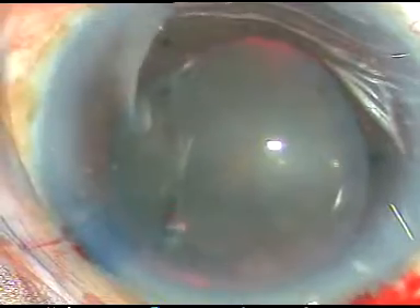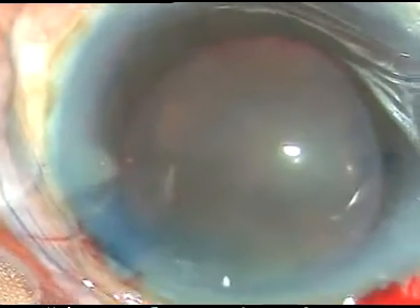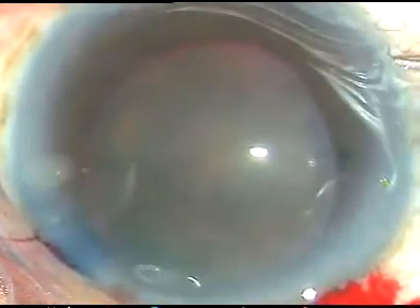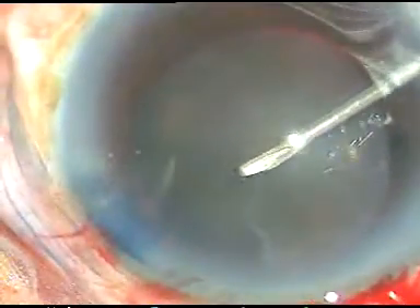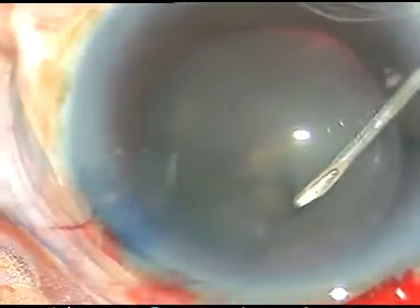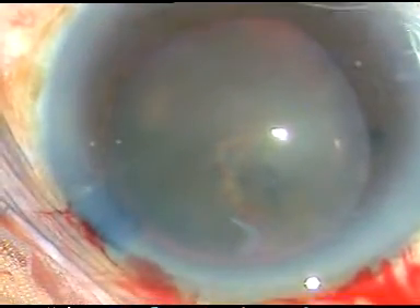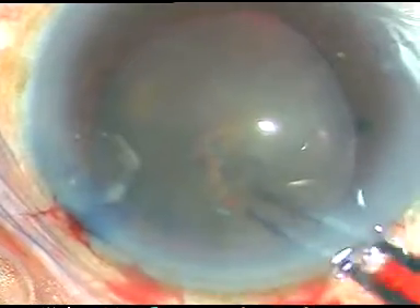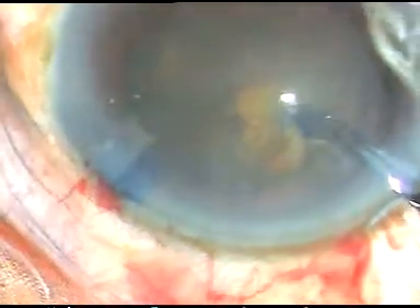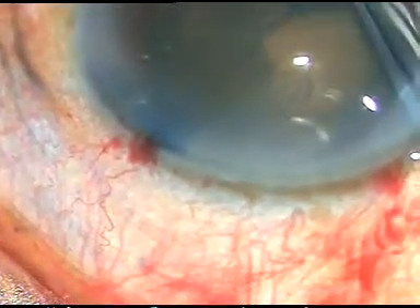Now is the time to do capsulorrhexis. See what happens when I try to incise the anterior capsular rim — as I try to incise the capsule, the whole lens moves. This indicates weak zonule. So, hard cataract, weak zonule, and the chamber was really very shallow — these were the challenges, and it was fun to overcome all of them.